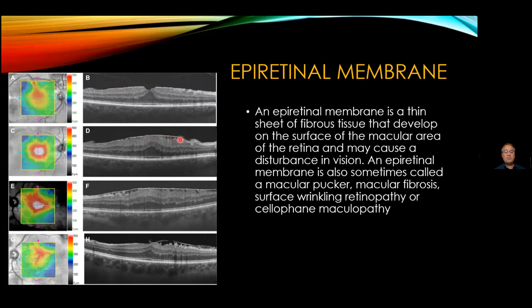They will certainly have metamorphopsia on an Amsler grid, or if you ask them to look at a straight line, they would definitely have symptoms. Quality of vision would be deteriorated. This patient might have very little symptoms with still good vision, because half of the macula with half of the fovea still seem to have a regular structure.